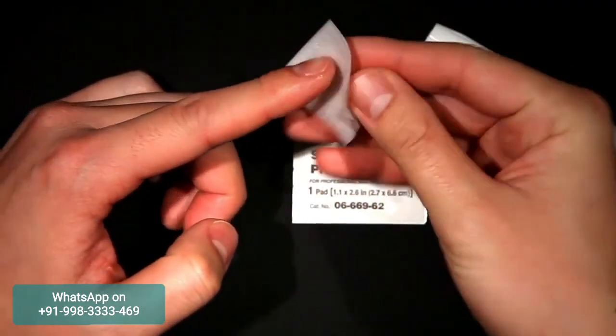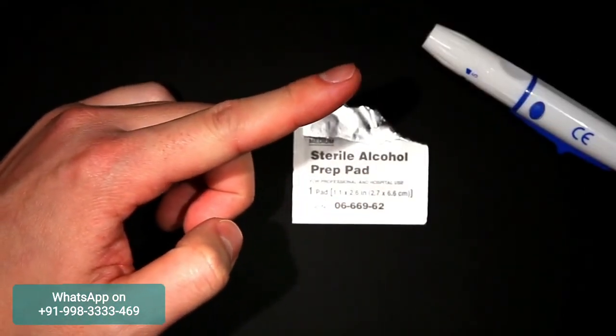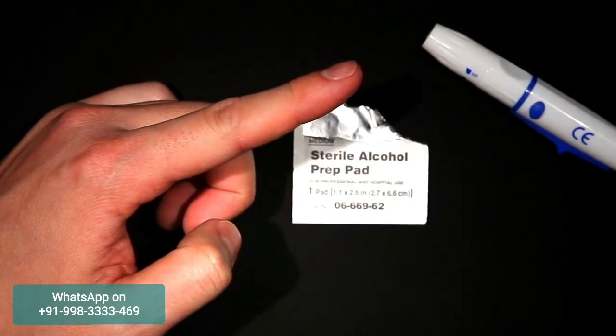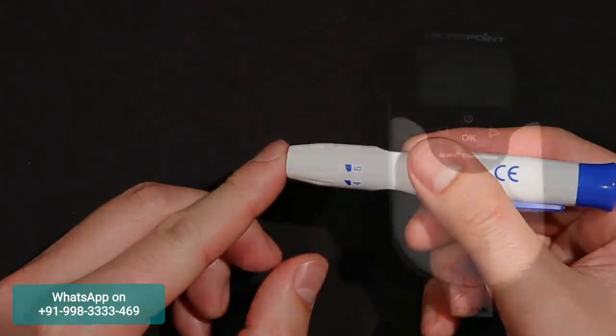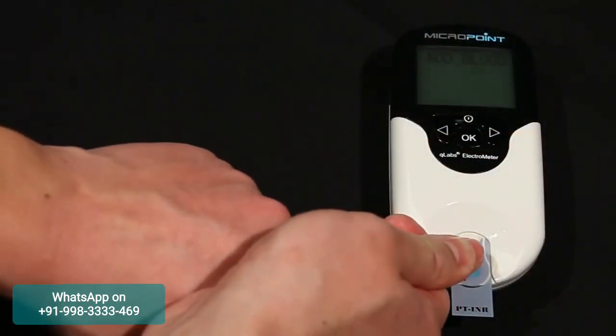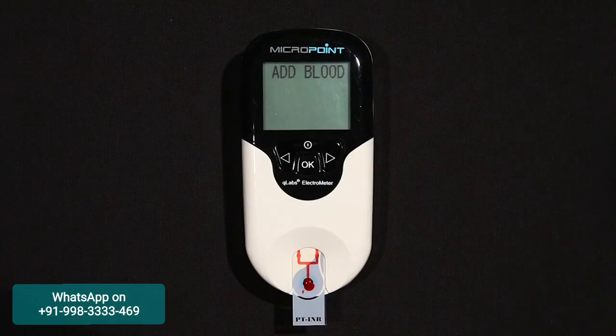Clean the area with alcohol and allow the site of the finger stick to become completely dry. If any alcohol remains on the finger, it may cause hemolysis, which may lead to inaccurate results. When completely dry, use a lancet to obtain the blood sample. Place the hand below heart level and make sure to apply the blood sample directly on the sample well of the test strip. The blood sample must be applied to the test strip immediately after collection; otherwise, the blood sample may begin clotting, causing inaccurate results. Be aware that plasma or whole blood samples with anticoagulation reagents are not suitable for the Q-Labs PT-INR test.